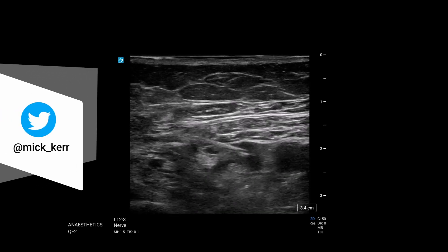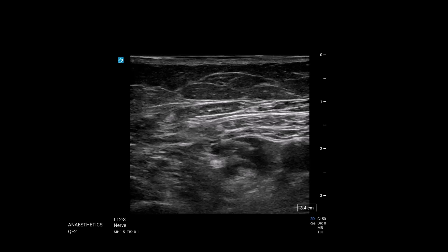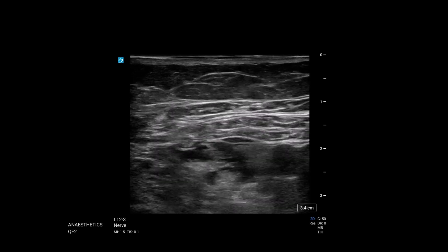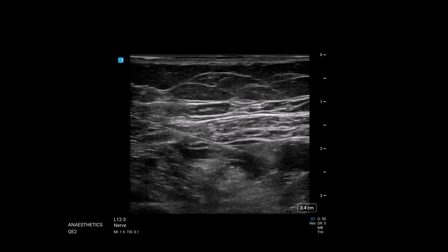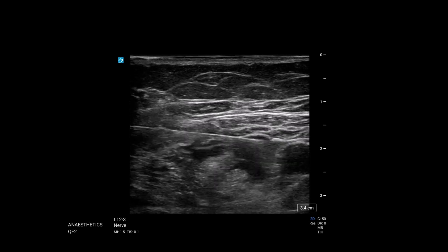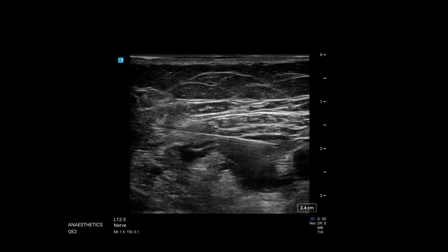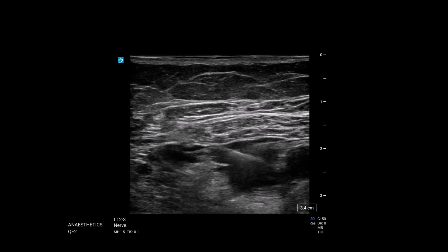I'm going to do a little bit of fiddling. There's a good sense — can you get the sense that there's a separate fascial compartment here and here? It's because there is. We're just tweaking the saphenous part of this injection now. So coming in somewhere around 10-11 o'clock to see if we can improve that spread a little bit. You can tell that there's a lot more differentiation around that saphenous nerve now, and a bit more local — sweet.